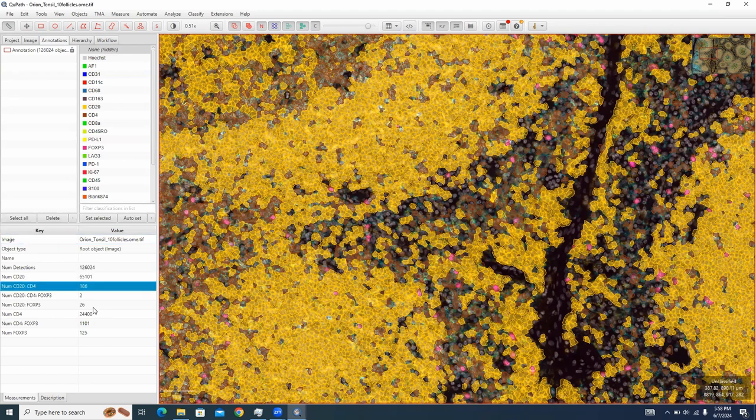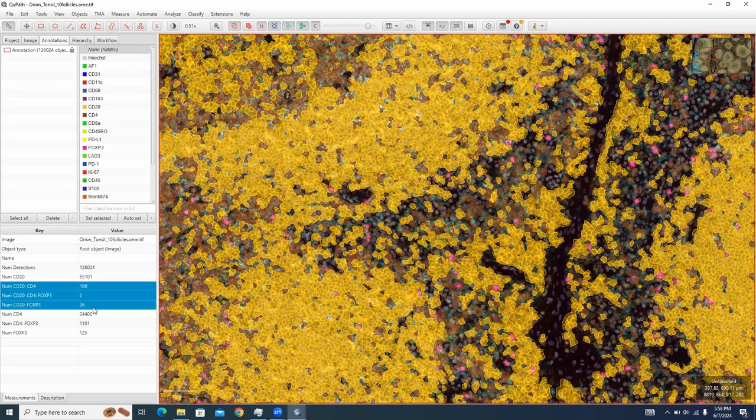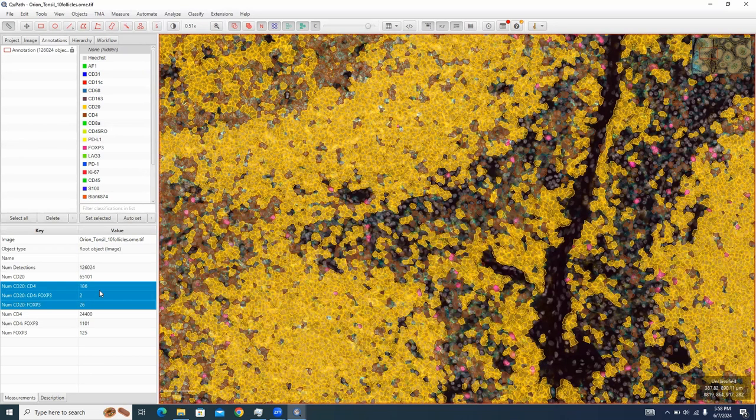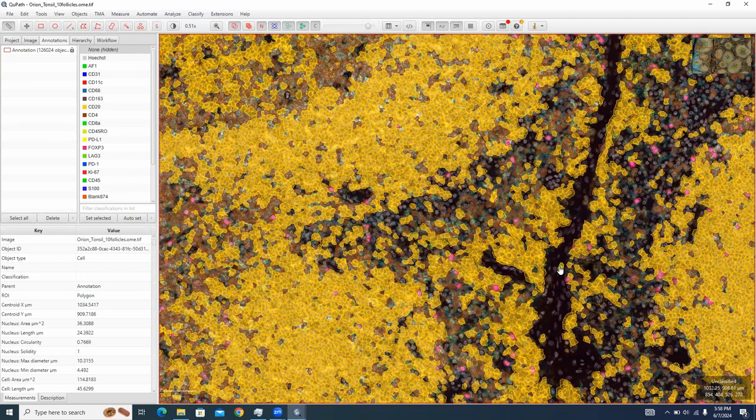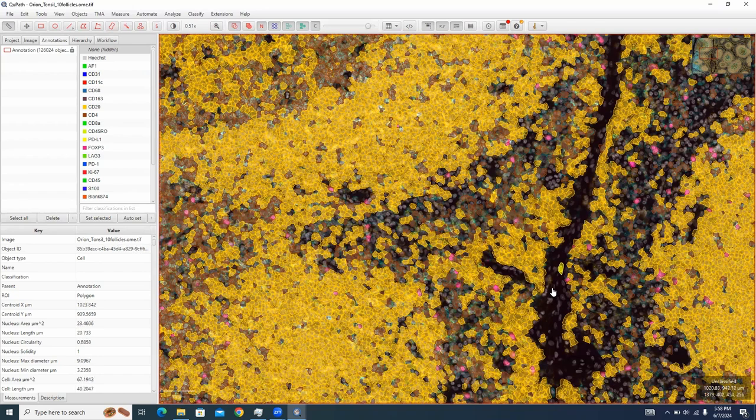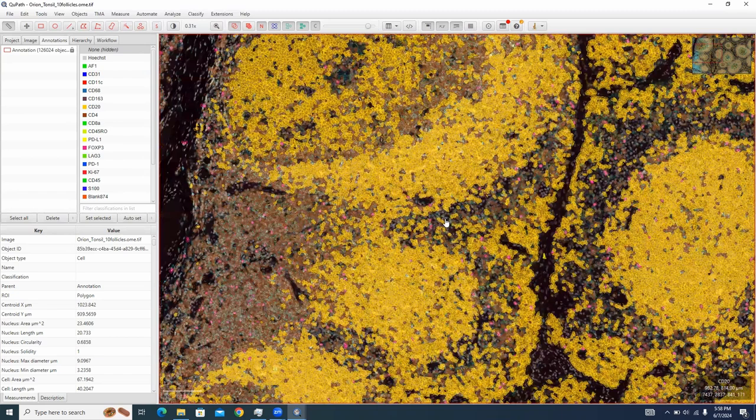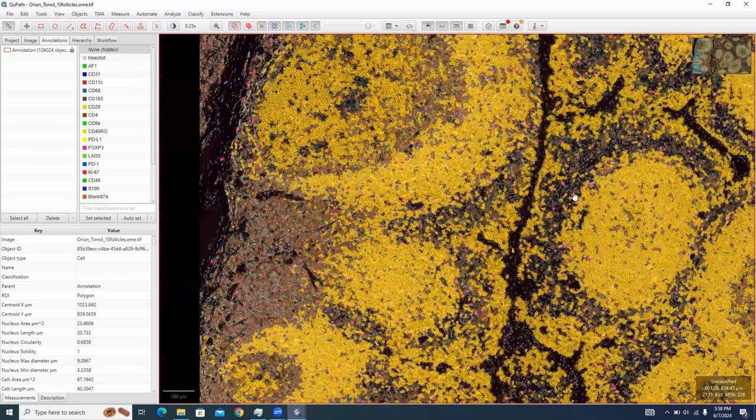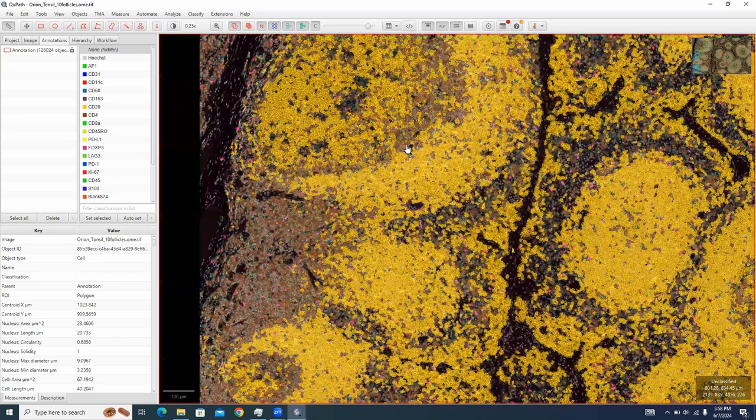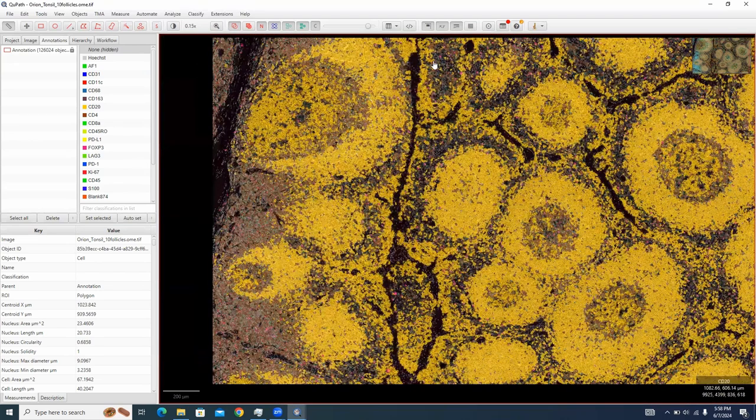So that's less than one percent error rate. So it's something like 0.3 percent error rate, which is just about the best you can expect out of the classifier. I should mention that's 0.3 percent definite error rate. There's probably other mistakes somewhere in here, but overall, it looks much better. I spent about 45 minutes improving these classifiers. Not an insane amount of time for how big and complex this tissue is. And this gets you to perfectly good, perfectly reasonable results. Great. Thanks.